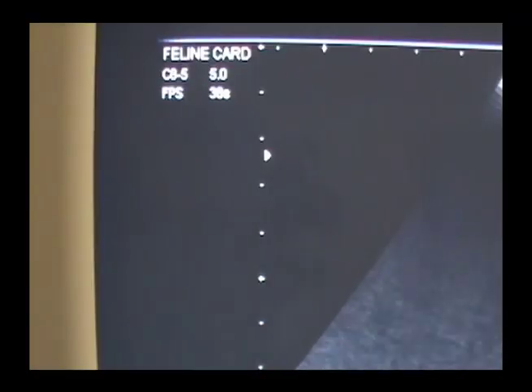Focal points are used to improve image quality at certain depths on the ultrasound screen. Some ultrasound machines require the operator to set and place the number of focal points desired for every image. The operator should constantly adjust the focal point, or points, to the areas of interest on the ultrasound screen. The operator must also choose the number of focal points to use.